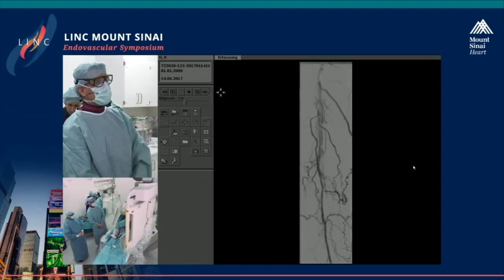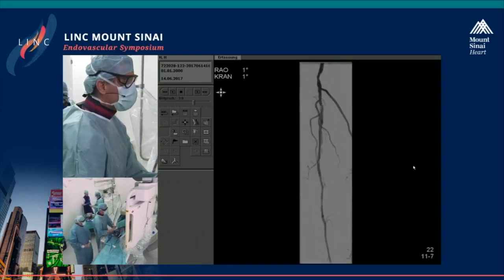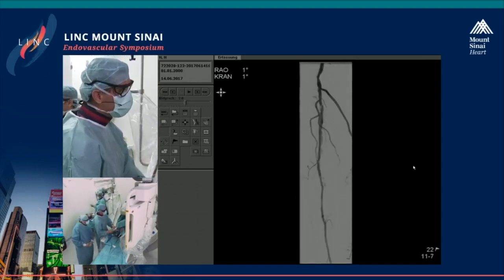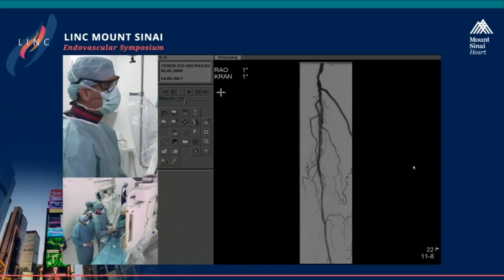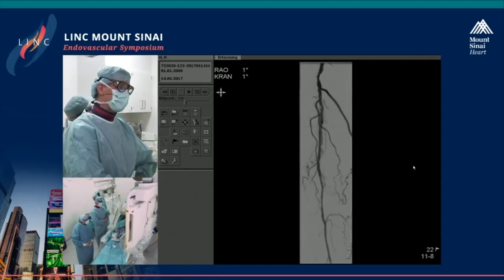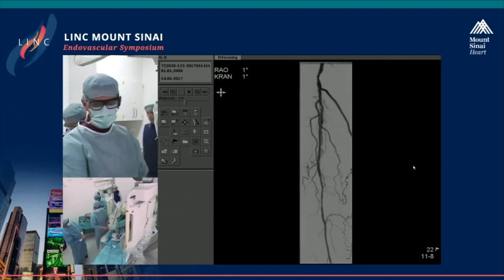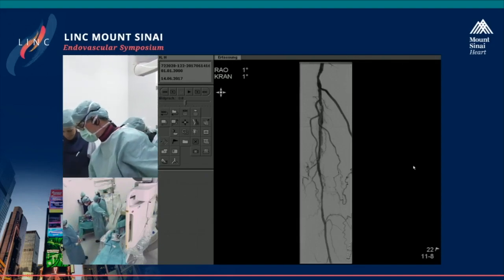Yeah, flow. Not sure whether this can be left without a stent. A little bit more work to do, exactly. Okay. So at the end, maybe indeed we need a stent here. Yeah, this is the area which looked awkward from the beginning after the crossing.